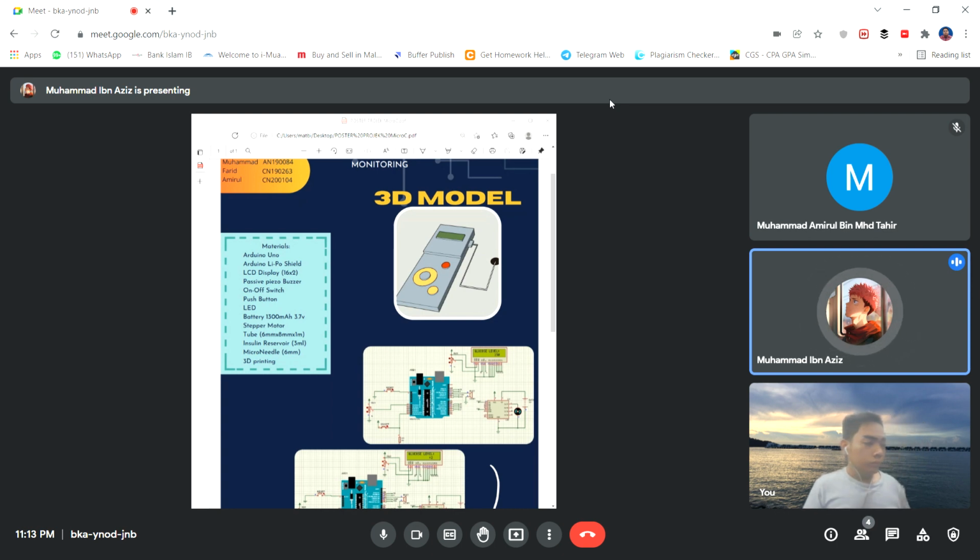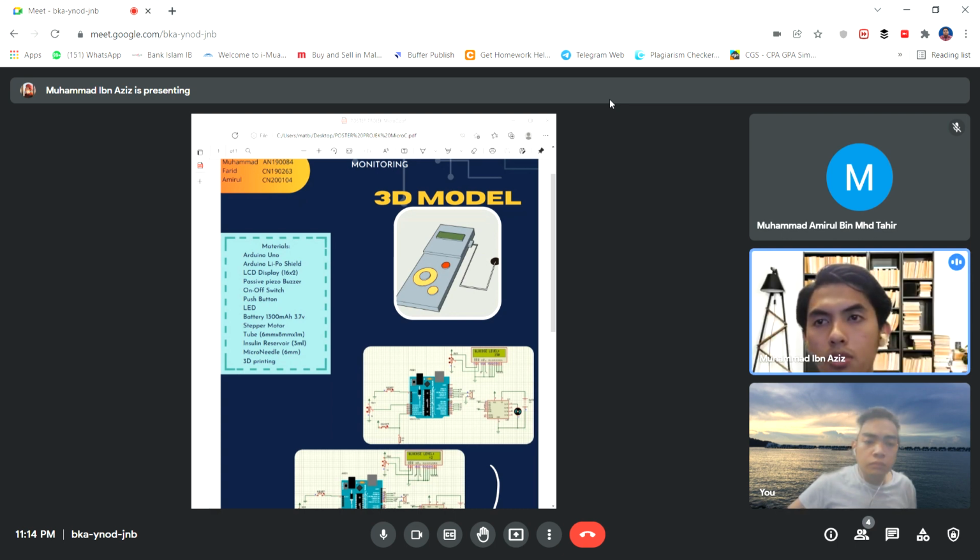Next, we have the on and off switch, which is to control the power delivery into the circuit. We also have a push button, which clears the memory and reboots the machine forcibly if anything goes wrong. Paired with this, we also have an LED. It gives an indication that the glucose sensor exceeds 150, so it is to confirm the piezo buzzer.